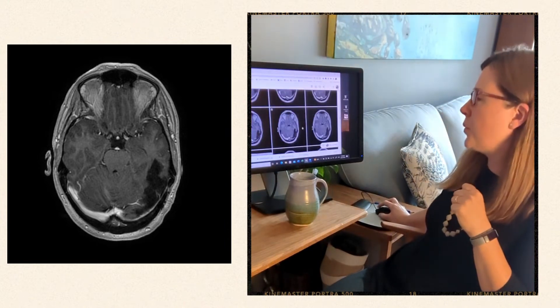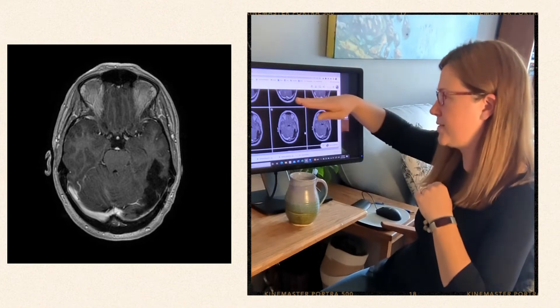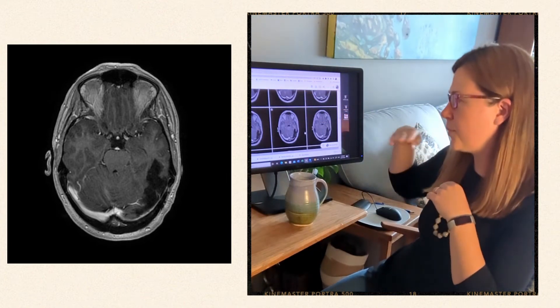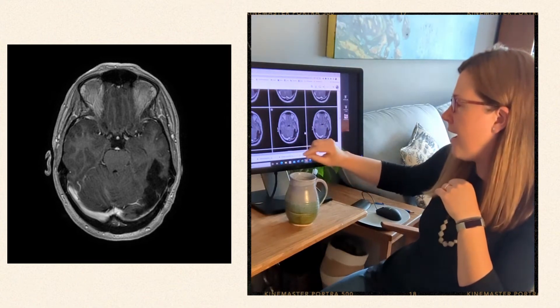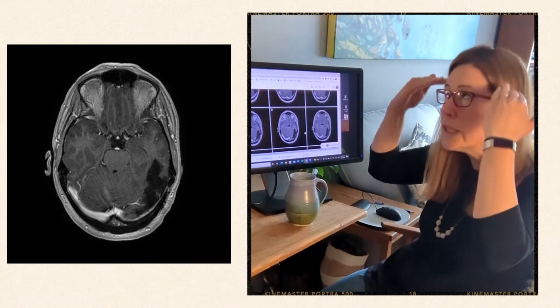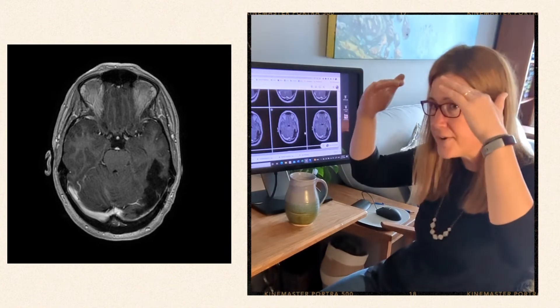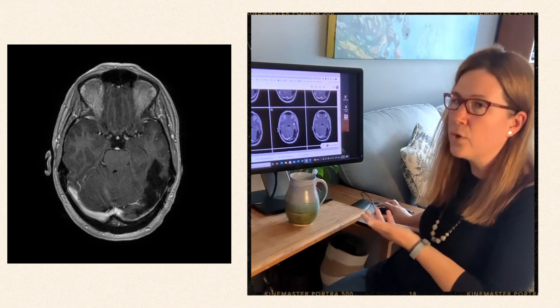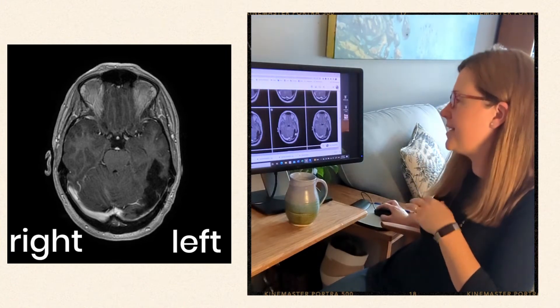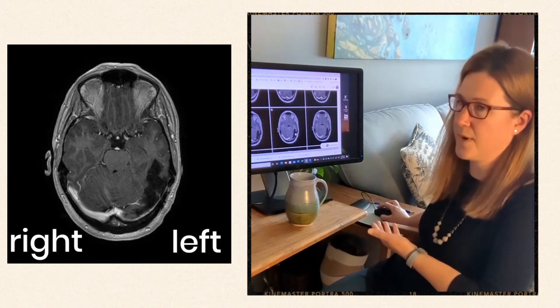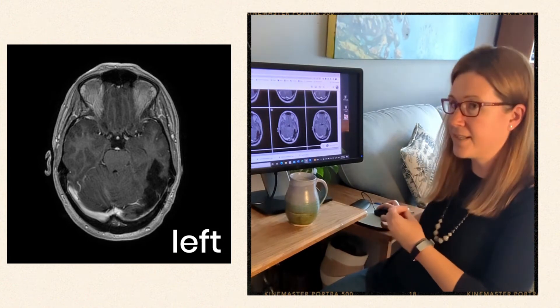What we're seeing here is a slice or a section through the brain — a horizontal section. So if I took a knife and cut from your eyes to the back of your brain, that's what we're seeing. You can see here's the front of the brain, back of the brain here. The slice is coming through lower down in the brain, in that temporal lobe region rather than higher up in the parietal region where the angular gyrus is. The weird thing about looking at these scans is that they're backwards — this is actually the left side of the brain, although it's on the right side of the screen. That is where Rebecca's stroke was, on the left side of the brain. The back is the occipital region.